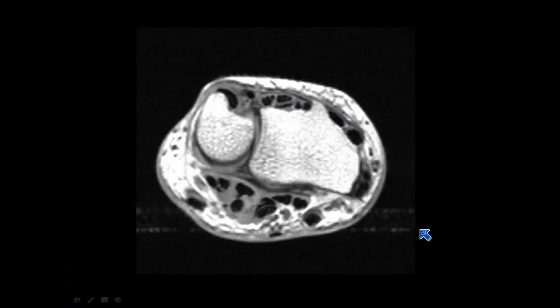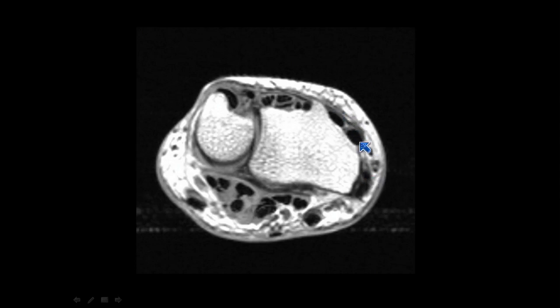This is an axial T1-weighted image showing all these tendons — both the flexor and extensor tendons. The extensor tendons in particular are injured in these sports, so it's very important that in our interpretation process we interrogate their integrity. They are conveniently broken up into compartments: the first extensor compartment contains the abductor pollicis longus and extensor pollicis brevis; the second contains the extensor carpi radialis longus and brevis. Lister's tubercle is a convenient landmark, and right next to it is the extensor pollicis longus. The fourth compartment contains the digital extensors, the fifth the extensor digiti minimi, and the sixth — which we'll focus on — is the extensor carpi ulnaris.